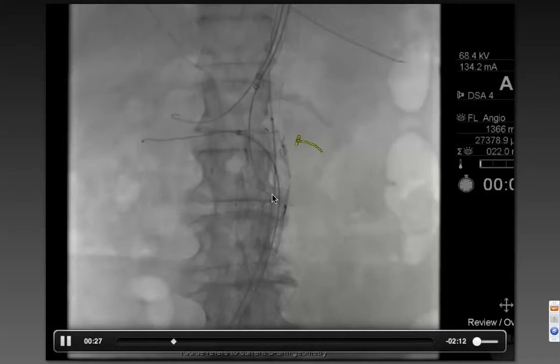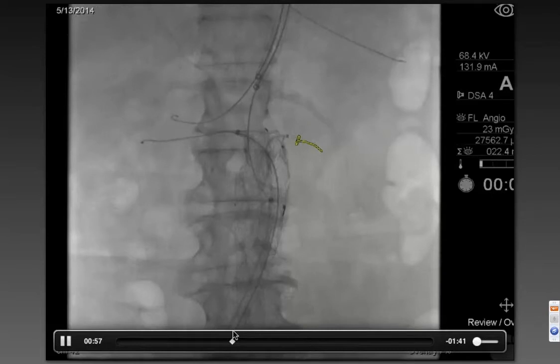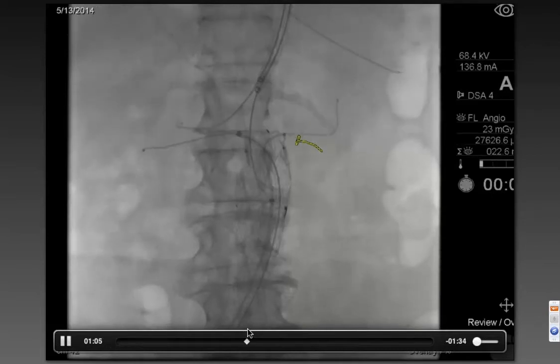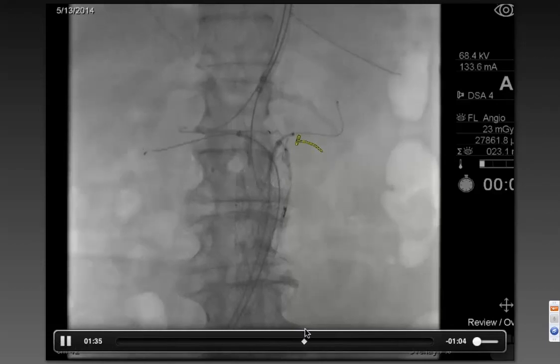Pull the wire back, put in the appropriate bend in the leader, and then catheterize that vessel. We're not quite as fast as I'm going to show you here, but you can see essentially how this works. We advanced the wire and the wire actually went up a branch — we reoriented that — but you can see it is through the origins, just going off through one of these branch vessels. We can reorient that with the catheter fairly easily.